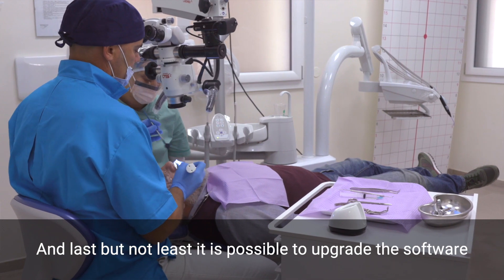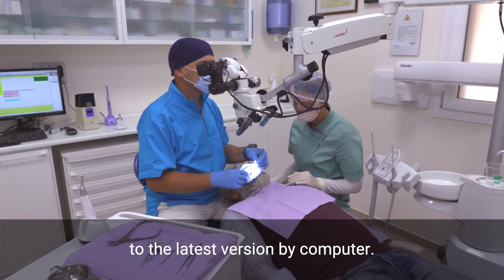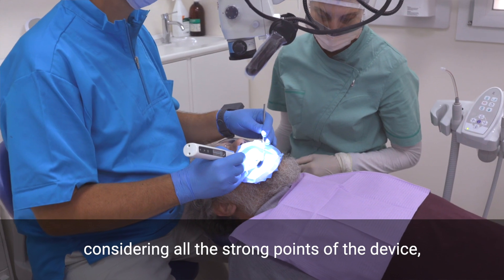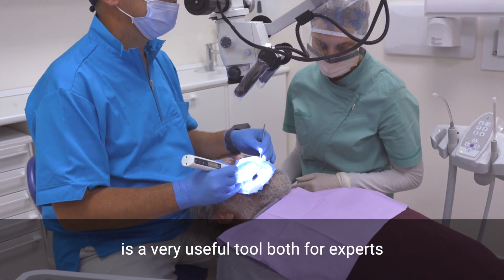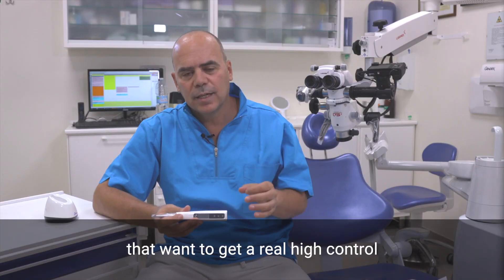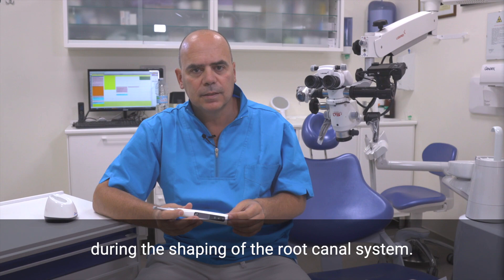And last but not least, it is possible to upgrade the software to the latest version by computer. To conclude, considering all the strong points of the device, I strongly believe that the E-Connect S is a very useful tool both for experts and general dental practitioners that want to get real high control during the shaping of the root canal system.